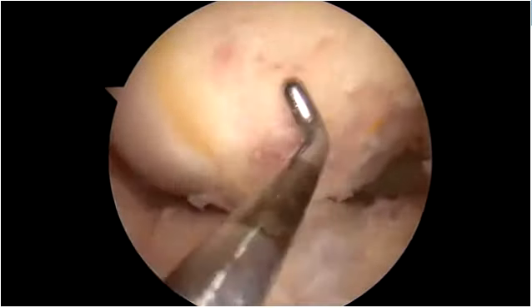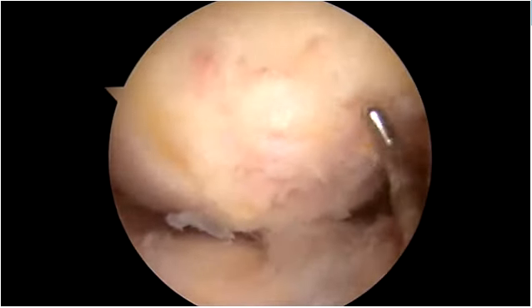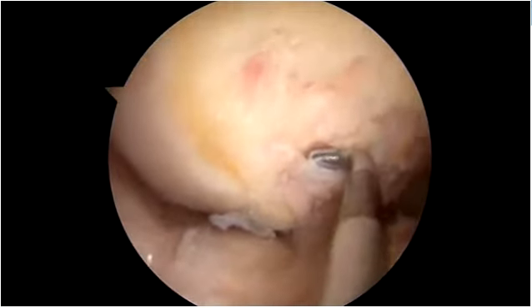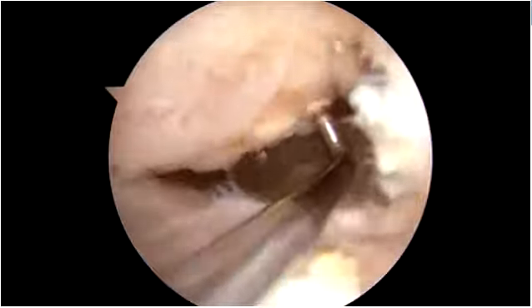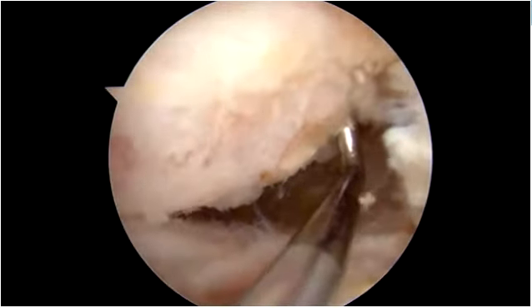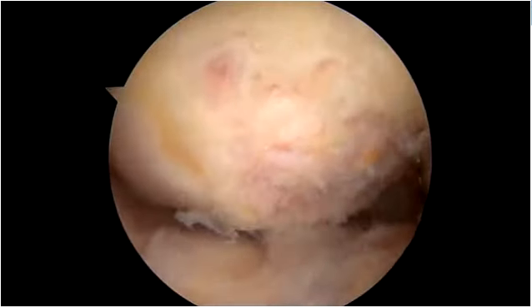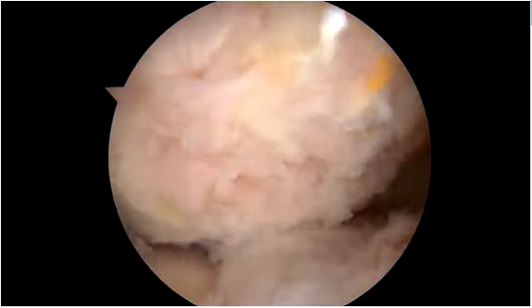Here's the ACL footprint right here. You see that? The ridge is right here. Can you see that? There's the ridge, and you can see the outline of the footprint. The other landmark, which is quite helpful, is the proximal cartilage border, which is right here. And that marks the deep part of the footprint. Charlie, can you outline the AMB and PLB on that for us?